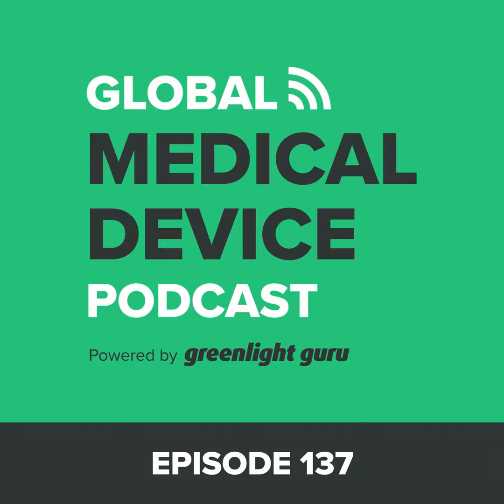And I think another reason people are hesitant or unsure about it is because in medical device software, you have this final phase of formal software verification. You can do system testing as you go, but you have to do the final verification at the end. So that usually wouldn't be part of your normal sprints. It would probably be a separate sprint in itself, or multiple sprints, to do that verification.